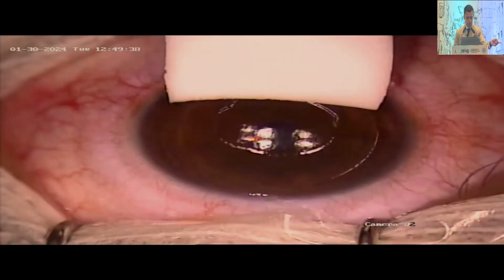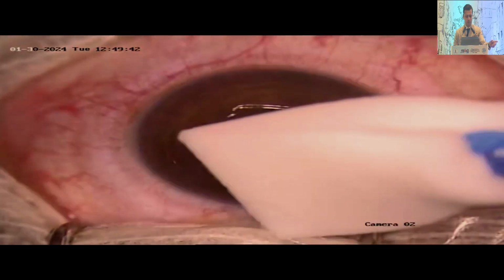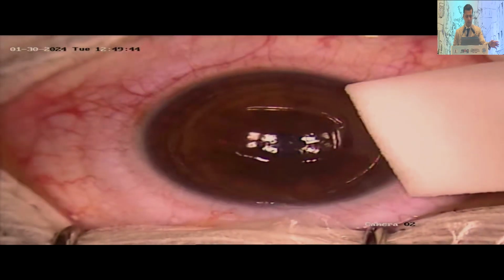And to my horror, I noticed what I saw over here. This is an area of uncut tissue. So I did LASIK for a low myope, and this happened. I did the other eye also, but when I was ironing up the other eye, I could see the central epithelium in the central 4-5 millimeters moving freely. So one eye I abandoned.